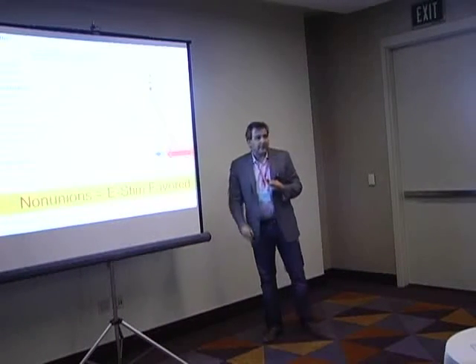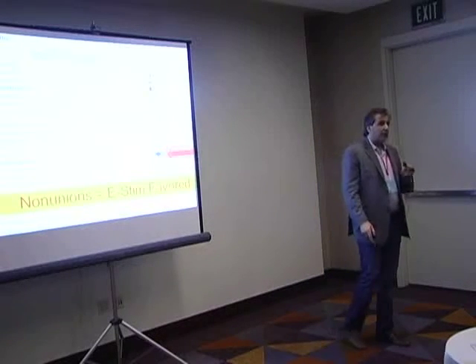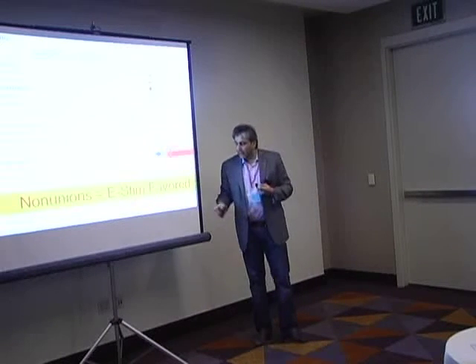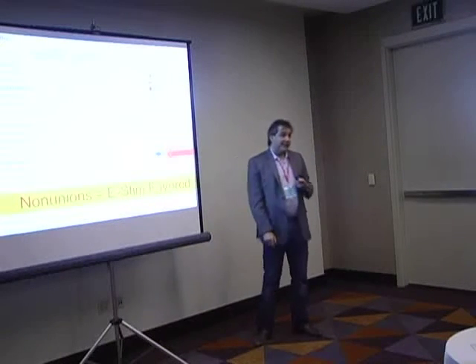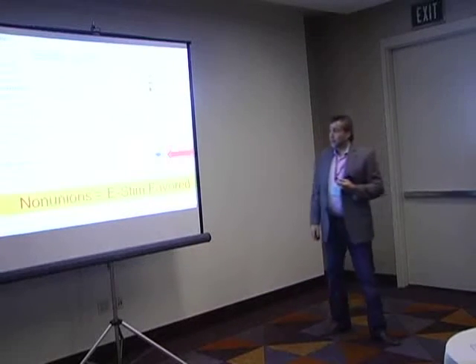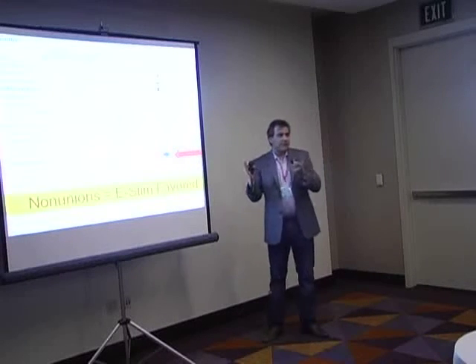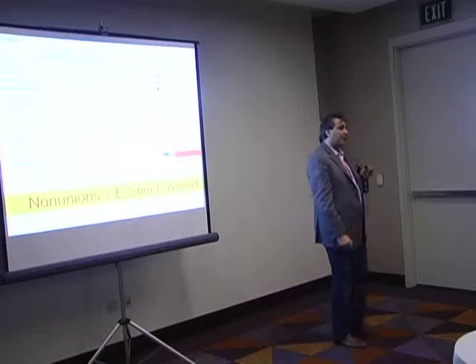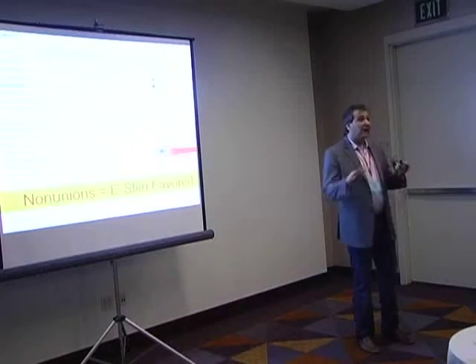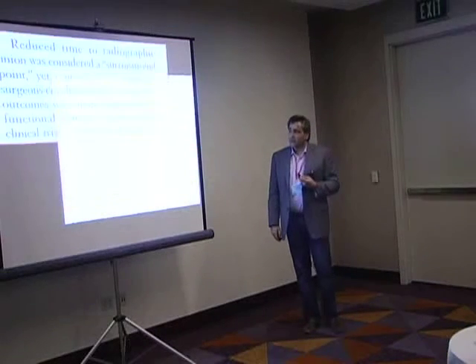But eStim seems to have a trend towards a stronger effect than ultrasound when it comes to delayed and nonunions. Again, this is not significant, but if you were betting, you might say it's favored. That's all you can say, maybe you could say it's trending, but it's not significant. So in other words, the purists would say there's no difference. And if you're looking at the numbers, you'd say one seems to be one way, one seems to be the other way. You can take it or leave it as you wish. So the point is, if you're using one product or the other, I don't think it truly matters at this point. Maybe more evidence coming out might suggest that there's a difference.